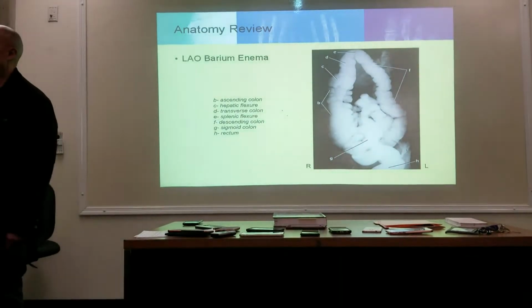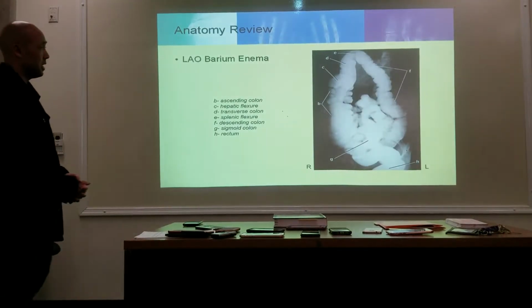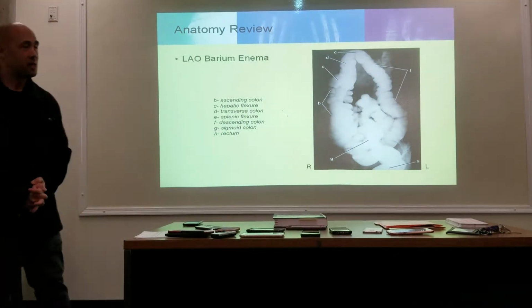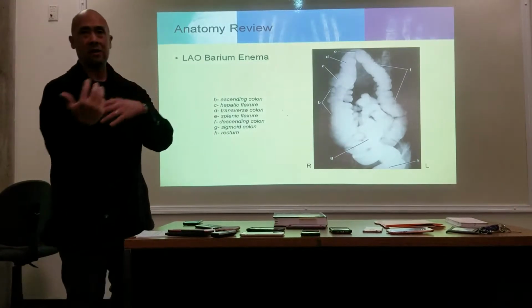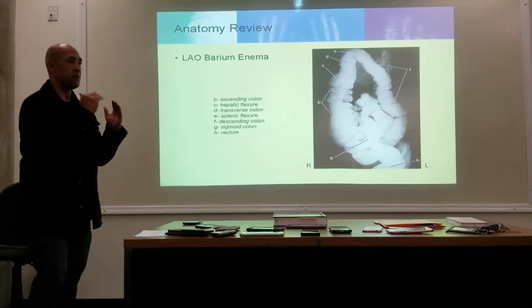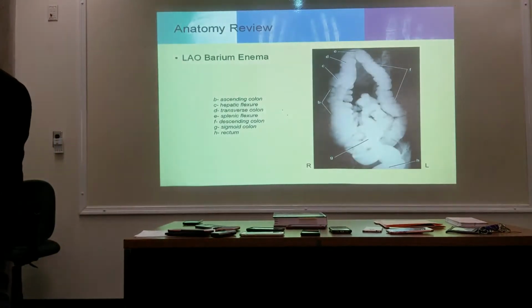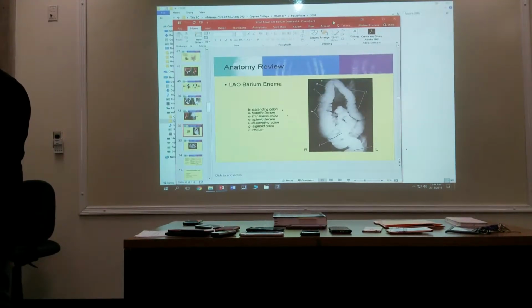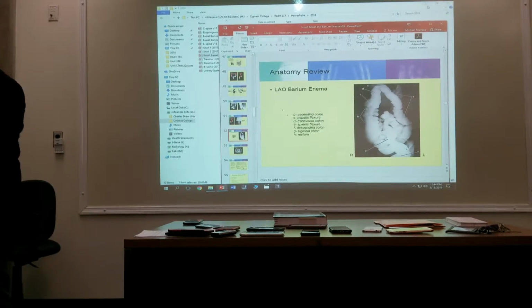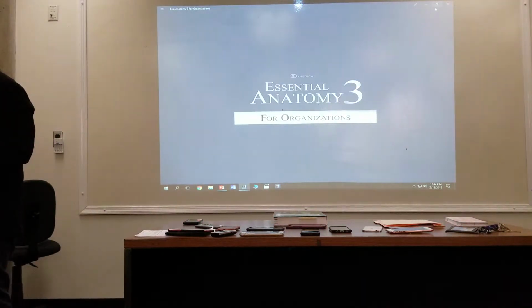Here in this position, this is an LAO position, single contrast. Everything looks kind of convoluted, right? Keep in mind that when you are rotating the patient, gravity puts things aside, and because of the position of the colon, it makes everything look compact. Give me a second to pull the app together, so it gives you a better visual of what we're looking at here.